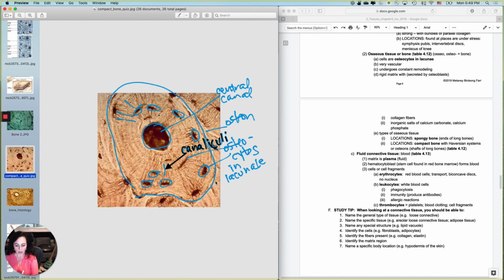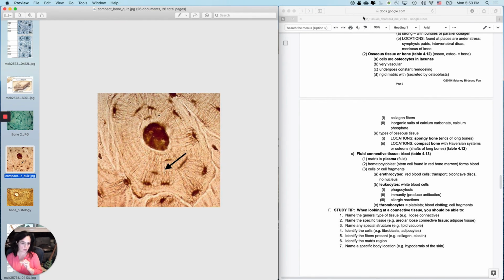Okay, that's good for that one. In the last video, we will just do blood, and then I'll give you some study tips for learning connective tissues like I did with epithelial tissues, and then we will be able to move on to the last tissues.